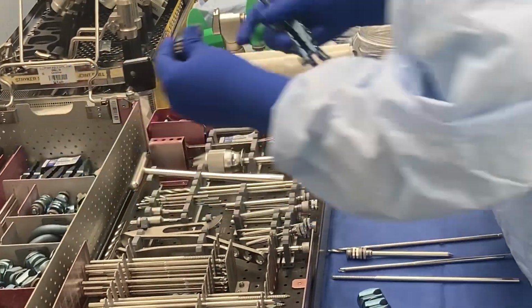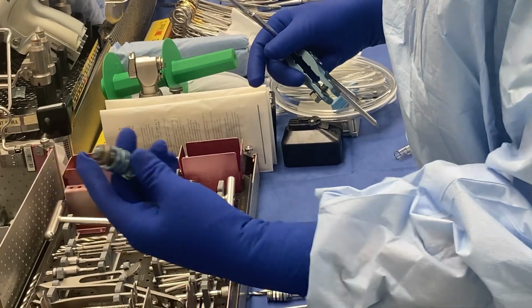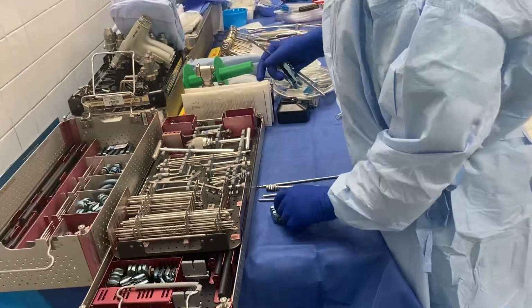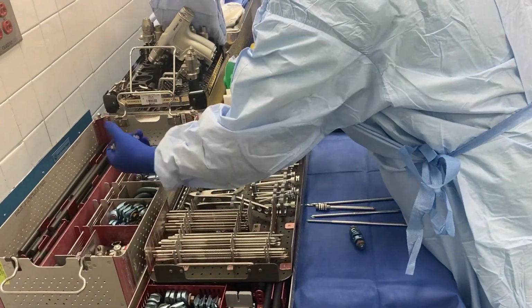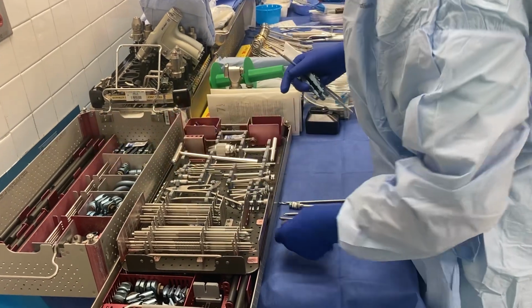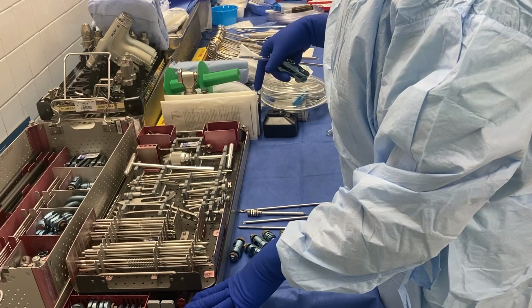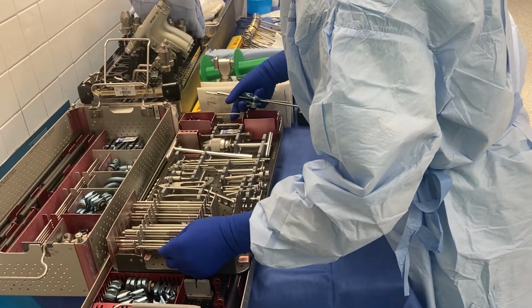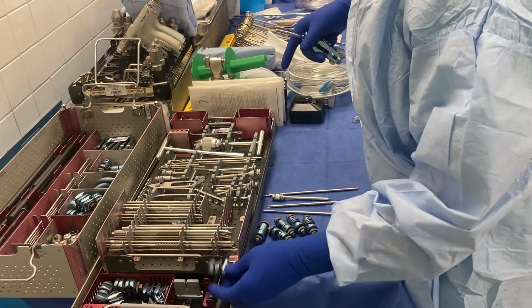And then some doctors like to use the pin to bar. They will only attach a bar to a pin. So either of those 2 options. I know specifically that this doctor likes the pin to bars. So I'm going to pull out mostly pin to bars, and a minimum of 4 on that as well. But again, we could add more if we have to start stacking bars to make it longer. Or if we have to attach 2 bars together, we can use a combi to attach 2 bars together.